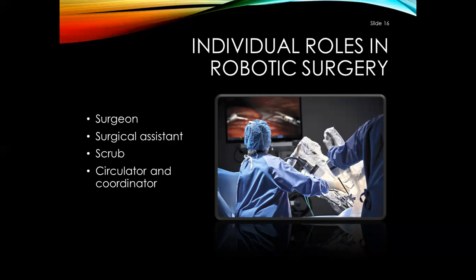Surgical assistant, and I'll read what it has here, but the surgical assistant is the one that usually puts the instruments in the arms and puts the arms into the trocars. Scrub tech is important because, first of all, he's going to be there for the minimally invasive part. He's got to help with that. Second of all, he or she has to have all the instruments and all the equipment that needs to be used in this case ready to be handed to the assistant to put into the cannulas.